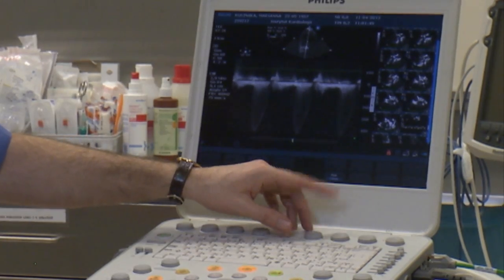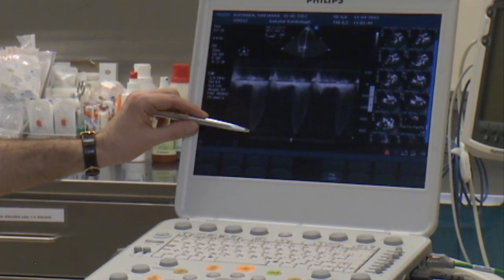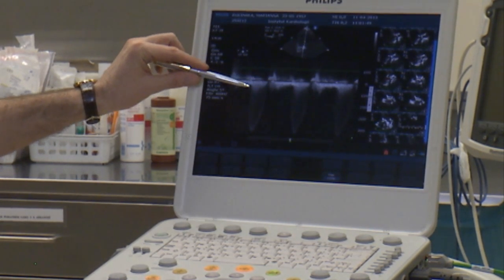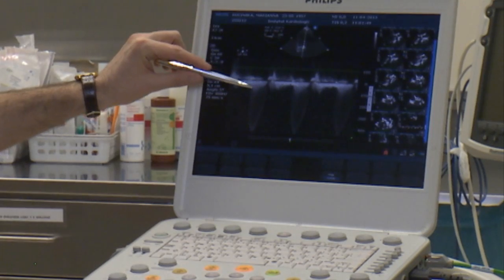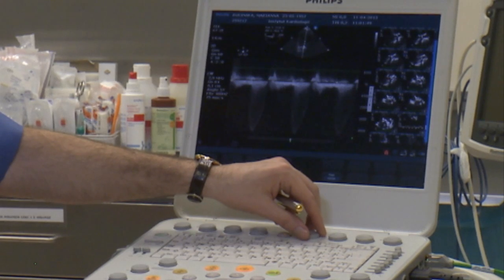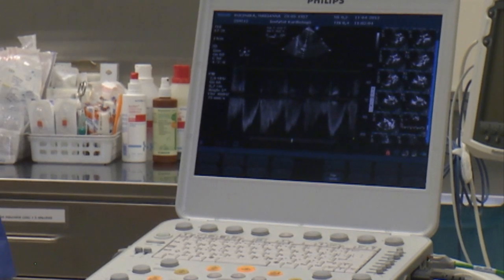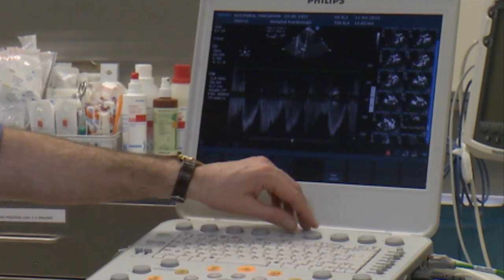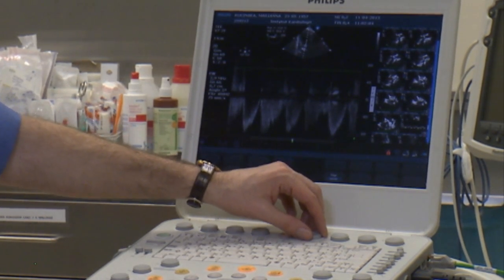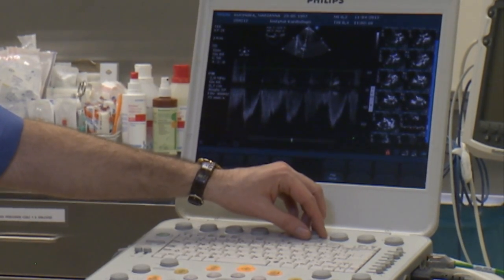The gradient itself is quite heavy. You can see large velocities over 400 centimeters per second, and that confirms that the stenosis itself is severe. There is a relatively low velocity in the LVOT, whose trace you can see over here. I'll show it to you in a moment. Just here, it's a little bit over 80 centimeters per second. So the ratio of the velocity through the aortic valve to the LVOT is well over 4. That makes the stenosis severe regardless of aortic regurgitation.